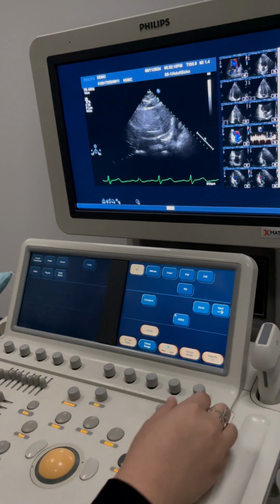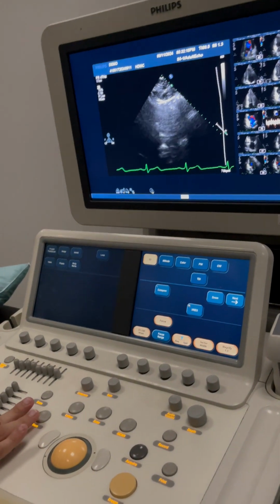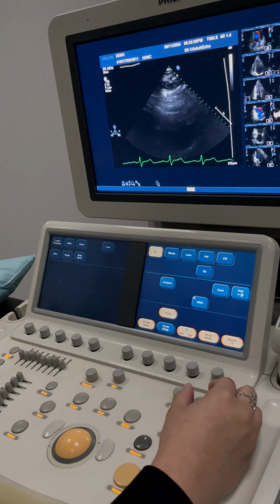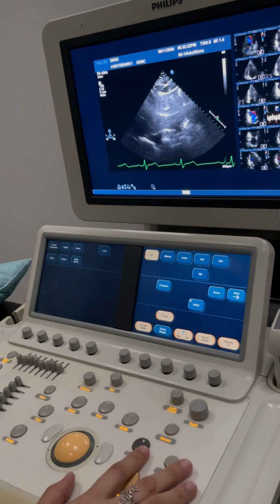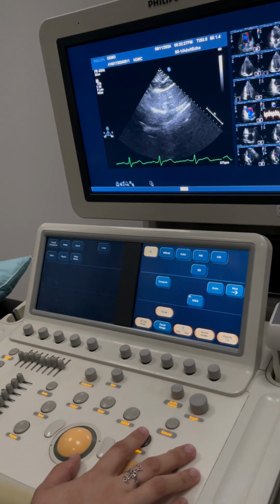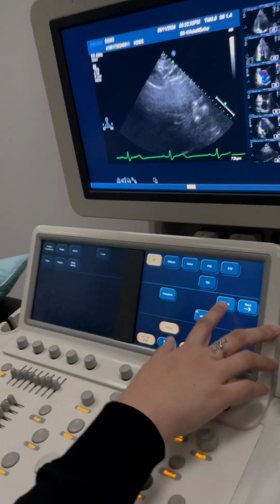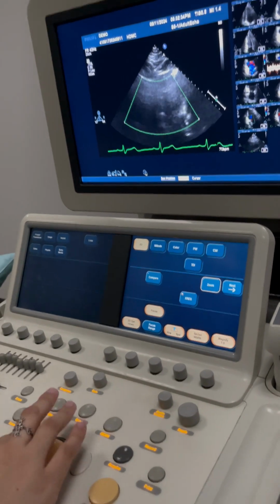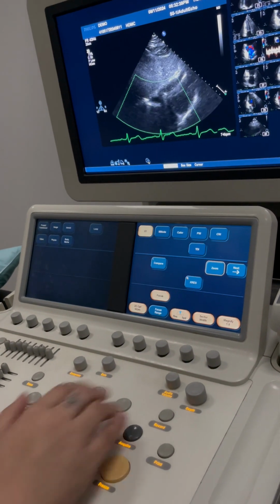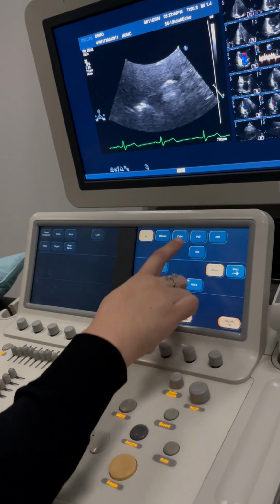Have you lay flat. Okay, go ahead and take a really deep breath. Hold it right there. Hold it, hold it, hold it. Store that. Okay, breathe out. Okay, now breathe in again. Deep breath. Hold it right there. Hold it, hold it. Store that. Okay, breathe out.